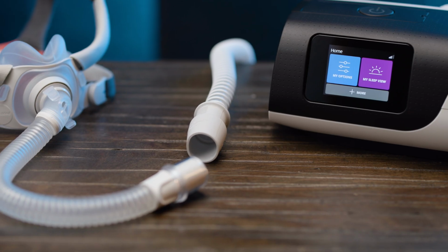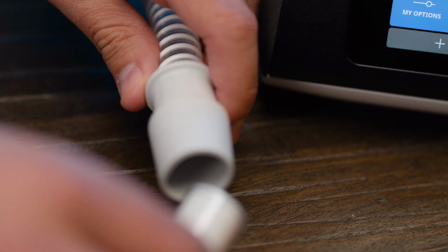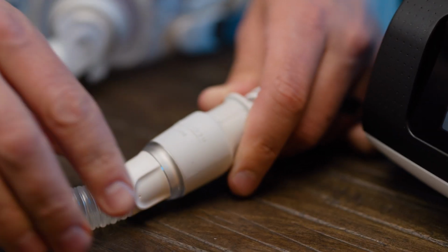The standard length is 6 feet, which is the length heated tubing comes in too. But you can get non-heated tubing at 8 and 10 feet long, or go the other way at 4 and even 2 feet long. The decision on length comes down to 3 factors: the position of your CPAP, how much you move in the night, and whether you use a humidifier. If you use a humidifier, best to stick with 6 feet or under to reduce the distance the moisture travels. And 6 feet is also great for CPAPs on nightstands and a sleeper that isn't overly mobile at night. That's why 6 feet is standard. It's a good all-round length.